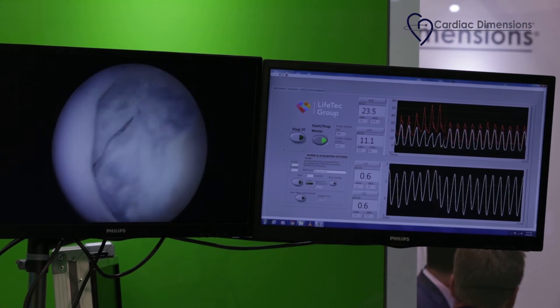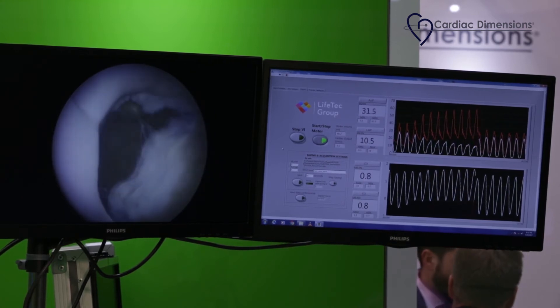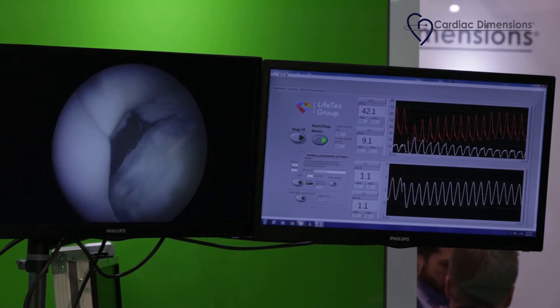As you can nicely see, the two lines separate, system pressure increases, and the valve is now competent. This is a normal valvular situation for the mitral valve.